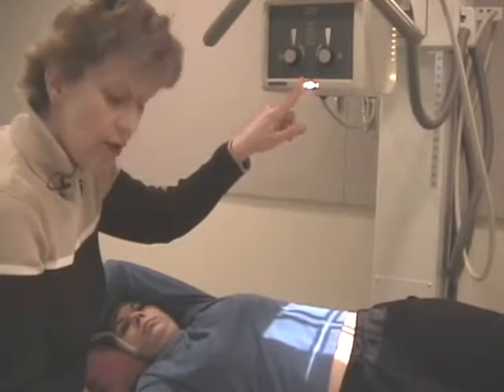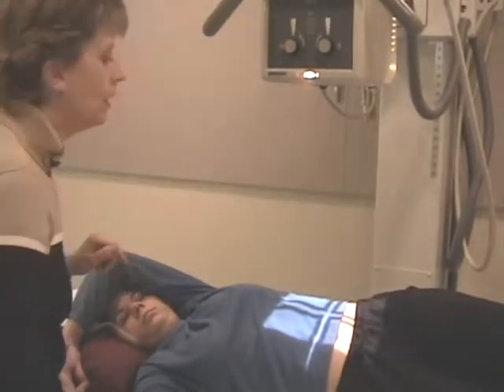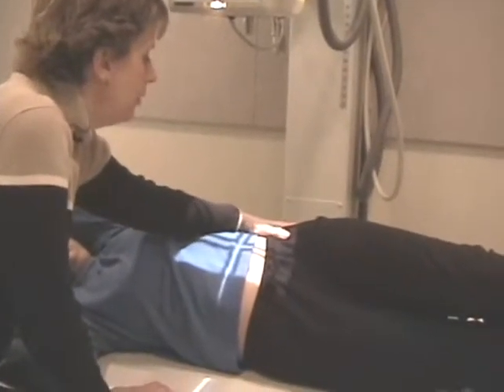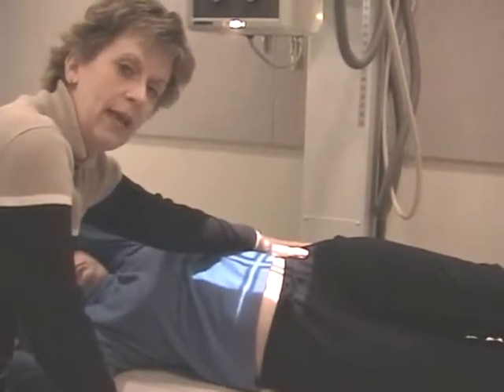My tube and my film are lined up. It's a floating tabletop. And now I'm going to find a bony landmark. I'm going to use the ASIS, that's the anterior superior iliac spine.